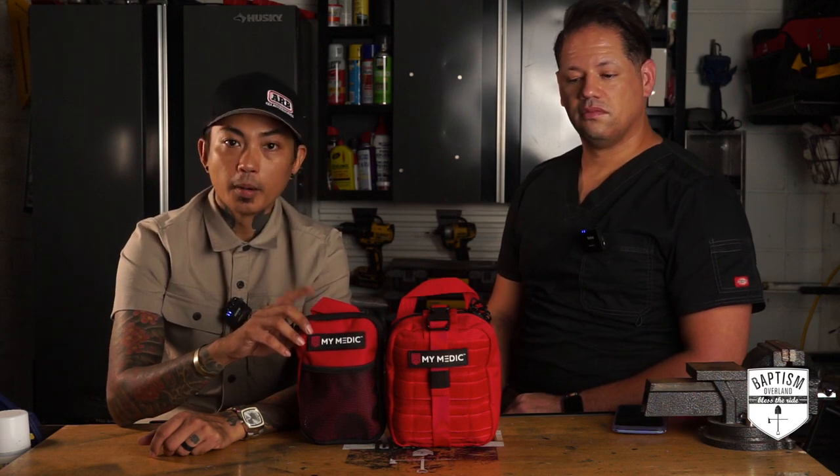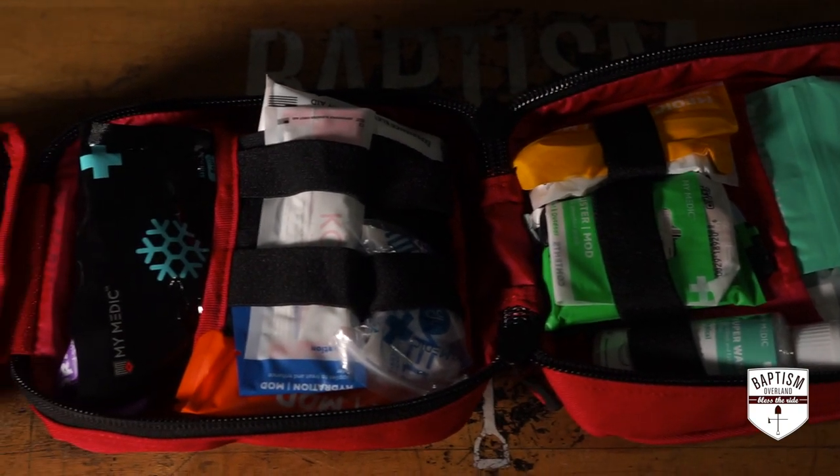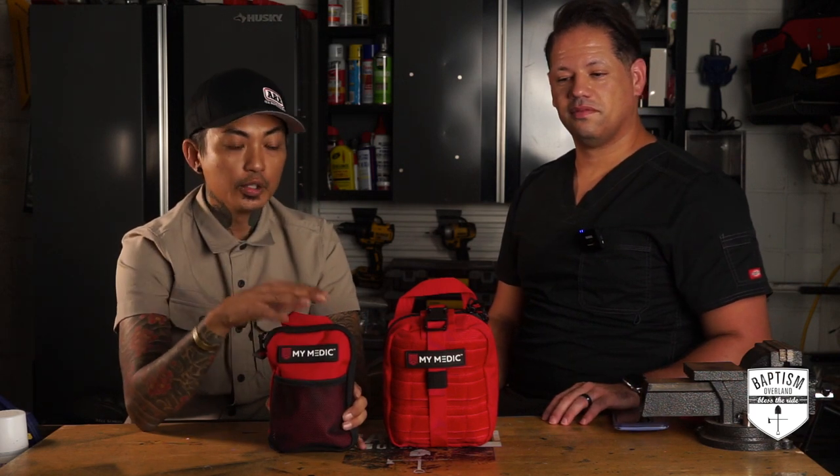If you are not aware, MyMedic is a leader in the industry when it comes to first aid kits. They have awesome kits, bigger ones, ones for marine applications and more. I'm so glad that Treadless decided to send me this stuff to review because it is National Preparedness Month, so let's talk first aid kits.